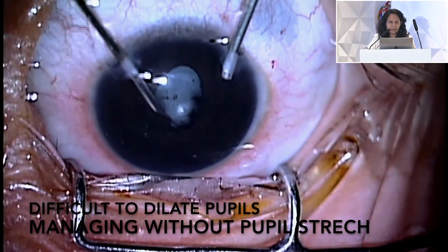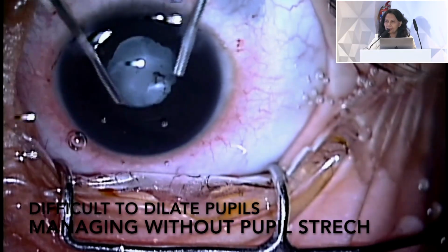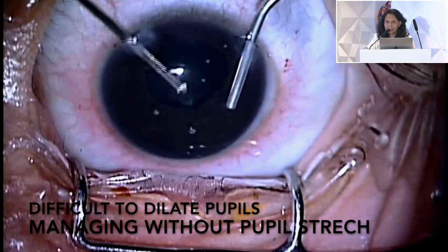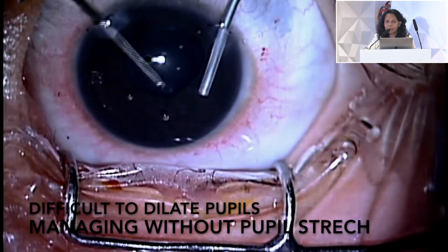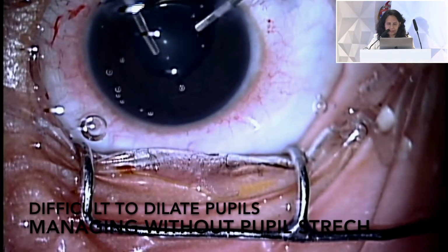And then this is another one. This is the inflammatory cataract. Sometimes even in the inflammatory cataract, if you break the posterior synechia, then it gets nicely dilated, and then you can do whatever you want to do, like membranectomy and then inserting the IOLs and all those things. This is the second video.